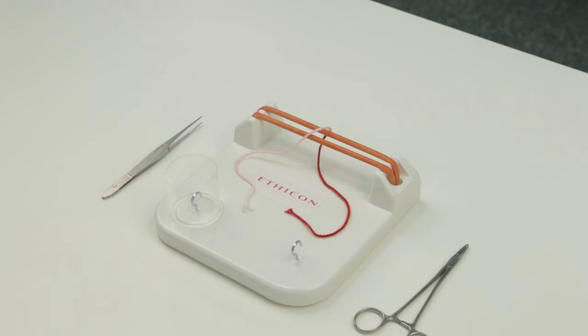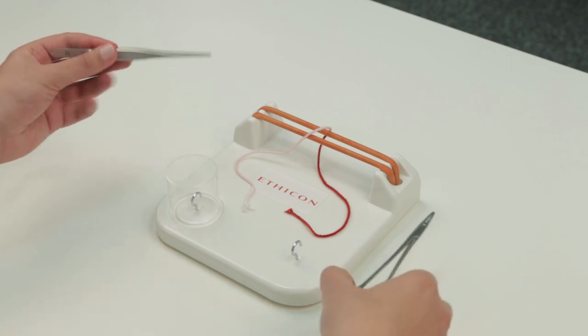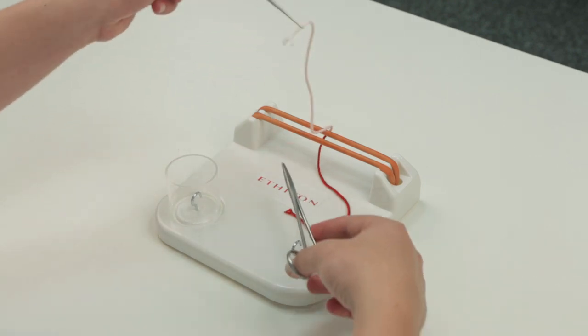For instrument tying, grasp the non-tying end of the suture with your forceps and loop it twice around your needle holder.